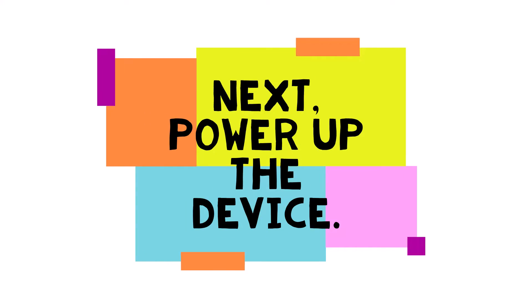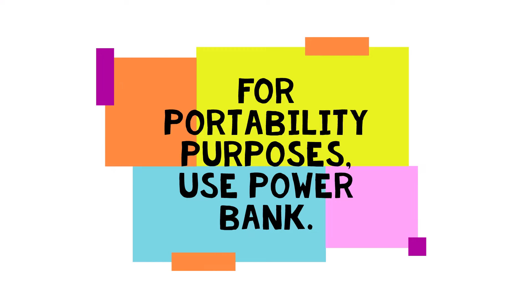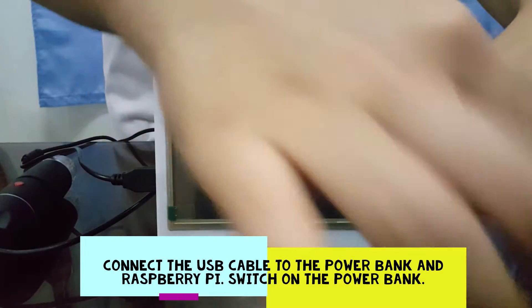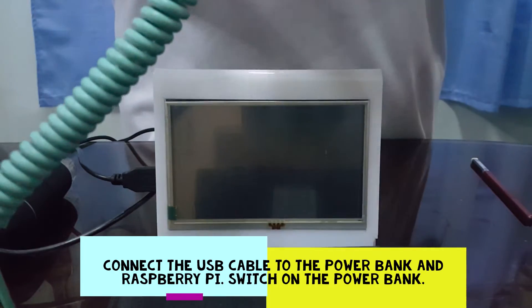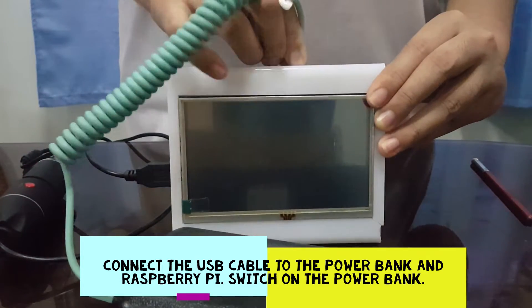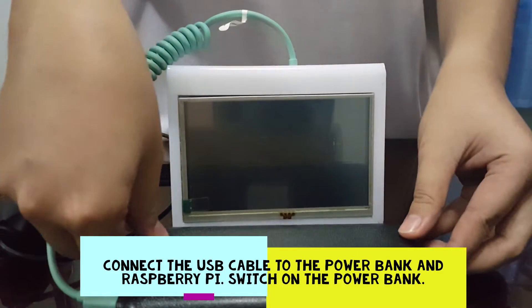Next is to power up the device. There are two ways to power up the device. First, for portability purposes, you can use a power bank. Connect the USB cable to the power bank and then to the Raspberry Pi, and then switch on the power bank.